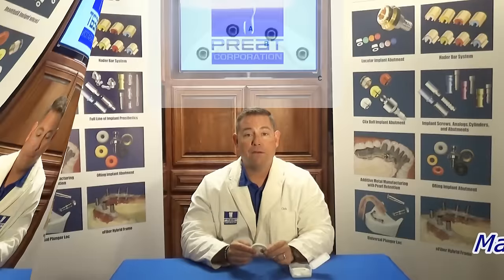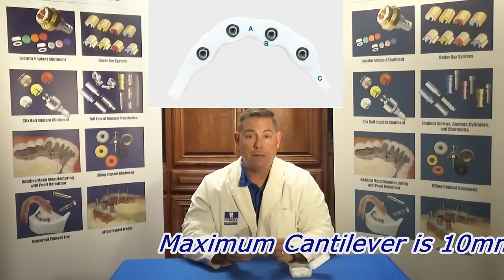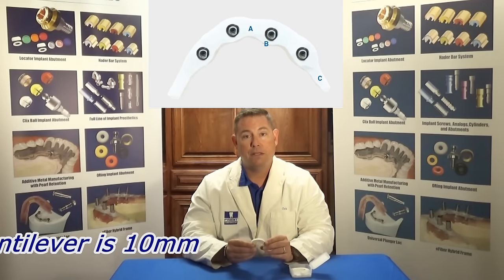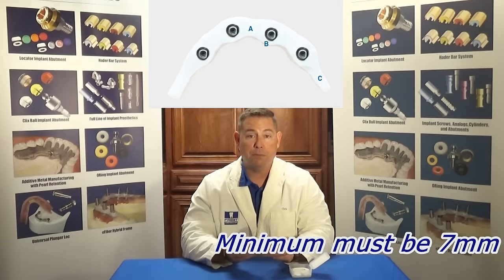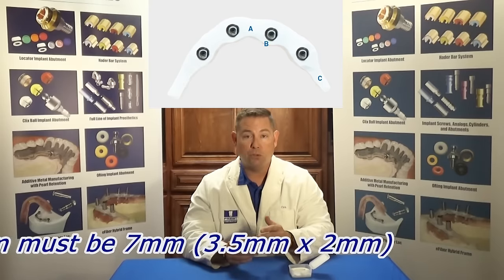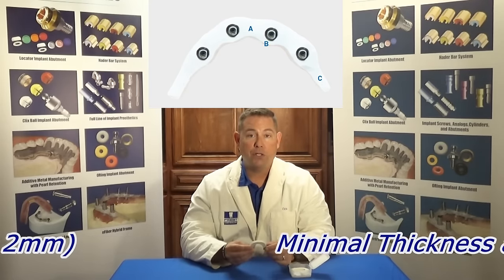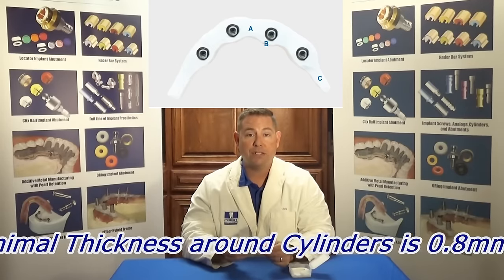Let's walk you through a case. First off, the parameters for the Trilor arch are that the cantilevers need to be a maximum of 10 millimeters. The connectors between your implant sites need to be 7 square millimeters of structure, meaning it needs to be 3.5 by 2 or somewhere around there. Third, you need 0.8 millimeters of material around your implant cylinders.